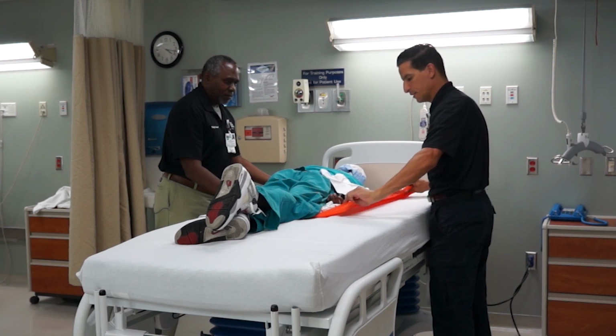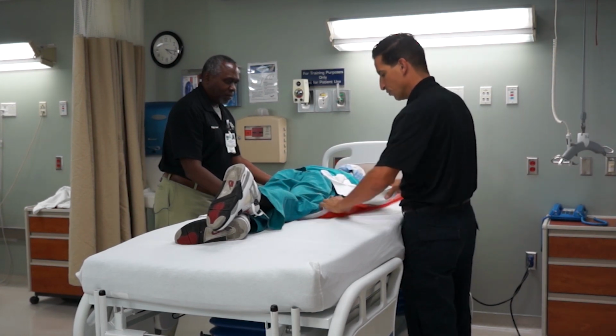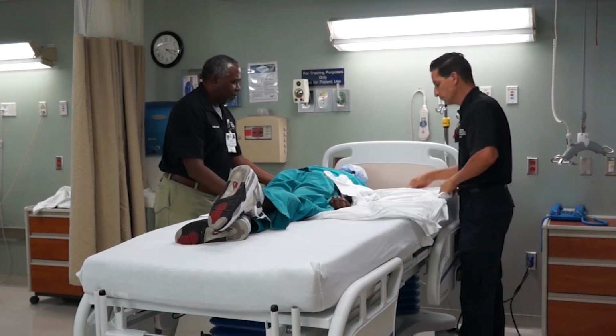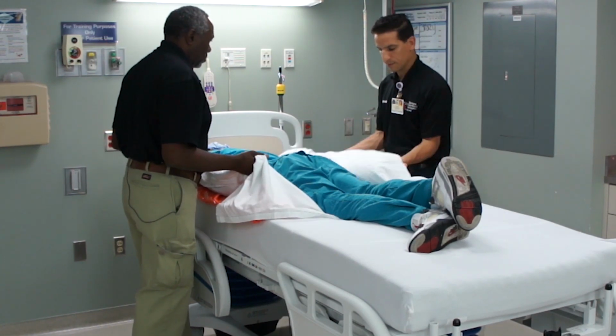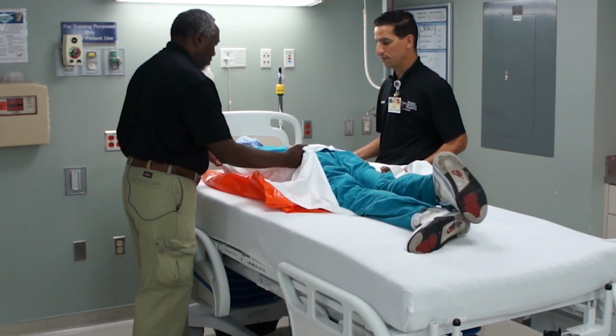Straighten out some of the Z slider here, and then pull through the new draw sheet. And then we can center the patient. Ready? One, two, three. There we go.